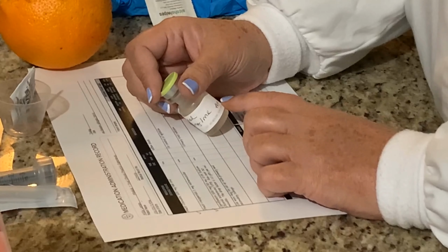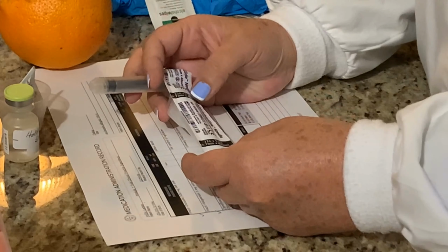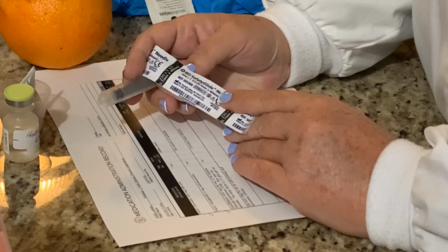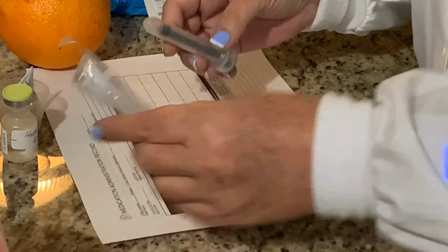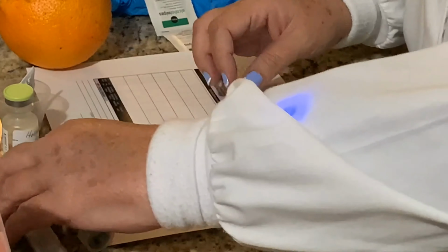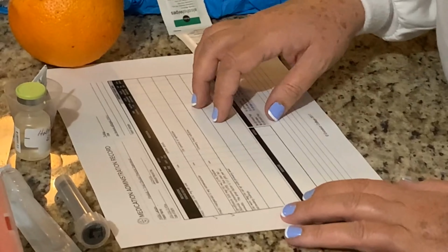I've also checked the expiration date, and I've got my syringes here. Now I have a 1.5 inch needle, which I probably would use a 1 inch needle for Millie, but I don't have that available. But if you verbalize, that would be fine. And remember that this is sterile, so you don't want to contaminate the tip of this or the top of your needle, which I'll show you in just a minute. So now that I've done my first check, I'm going to go prepare the medication.